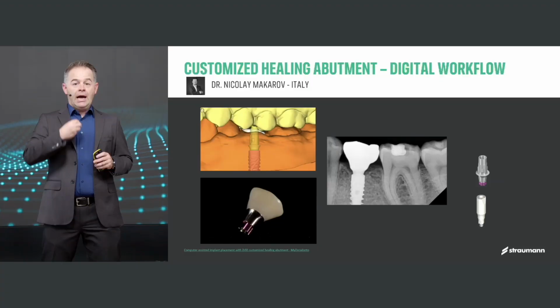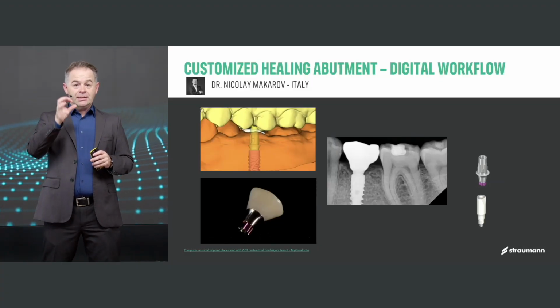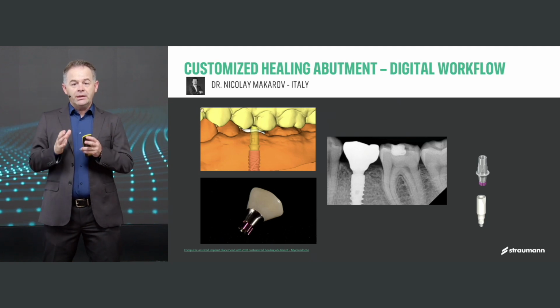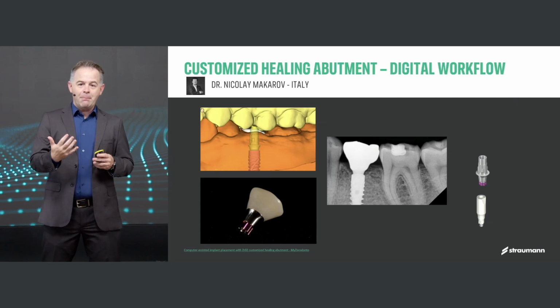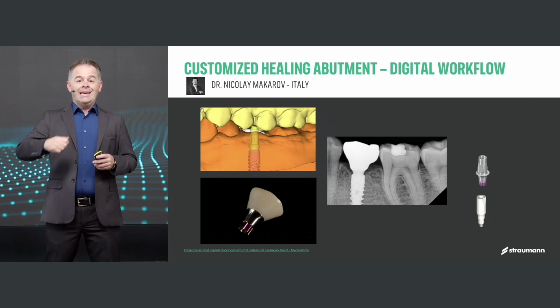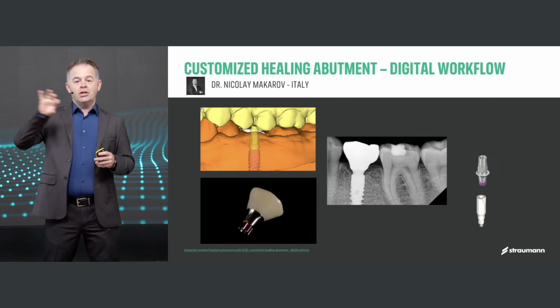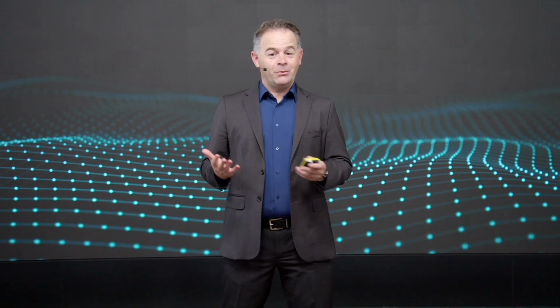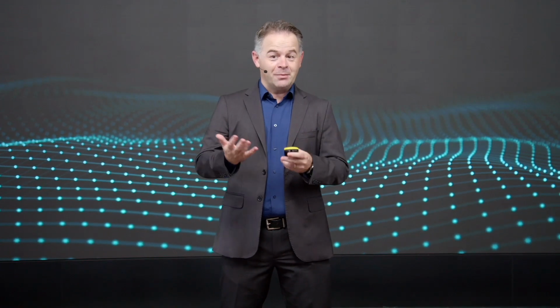However, this increases cost, because keep in mind, you're going to have an abutment, and then you need something to mill and cement onto this abutment, and invariably towards the end, you're going to need a scan body to scan that site. So you also have to remove this part, scan that site, and then shift towards the final prosthesis. Again, this increases cost, this increases a lot of chairside time, and increases the overall time to teeth, which the patient is also a bit anxious about.